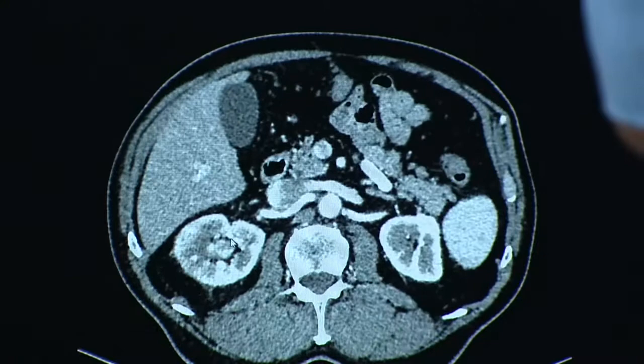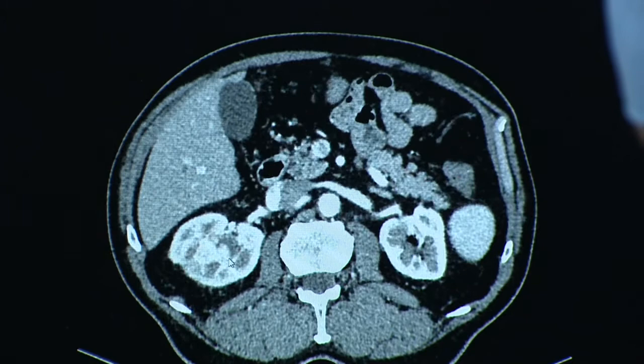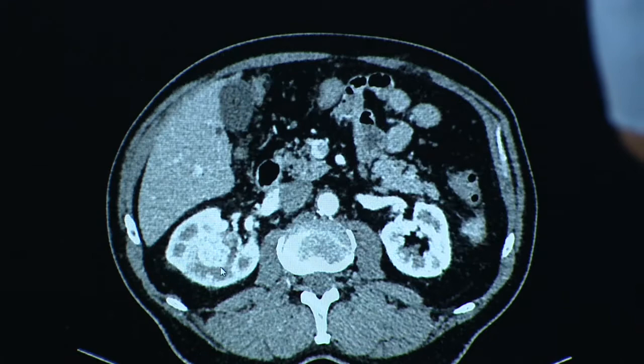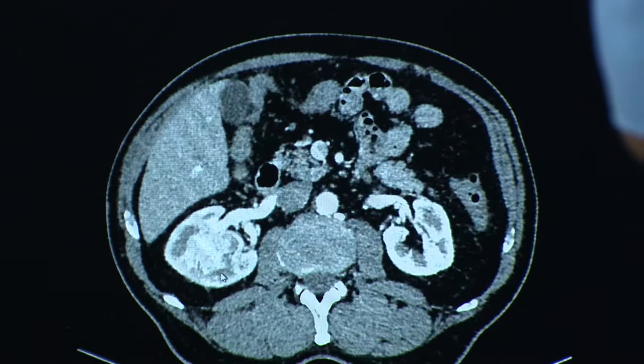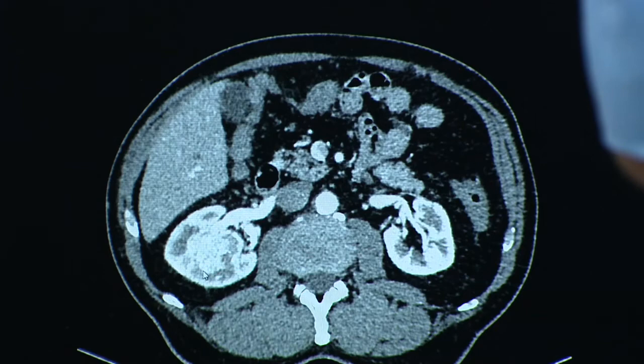Here is the tumor. You see that, Vito? Yes. Okay, all this is the tumor in the center of the kidney, right in the central sinus. Nice case. Yeah, lovely. Look at this. It is a little irregular, a little irregular contour, and completely intrarenal. All this is tumor.